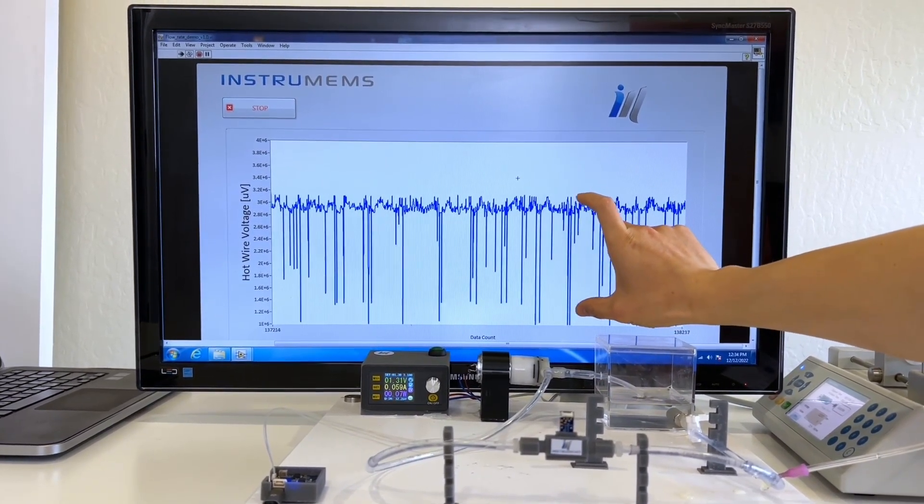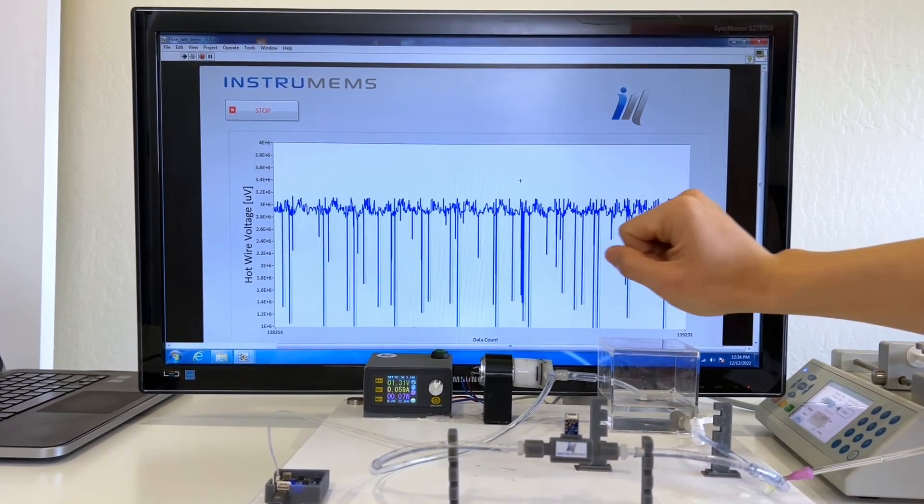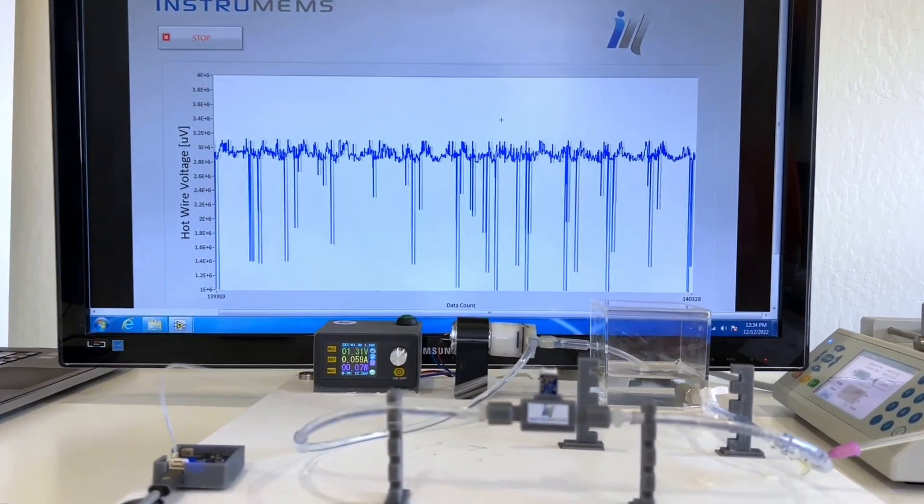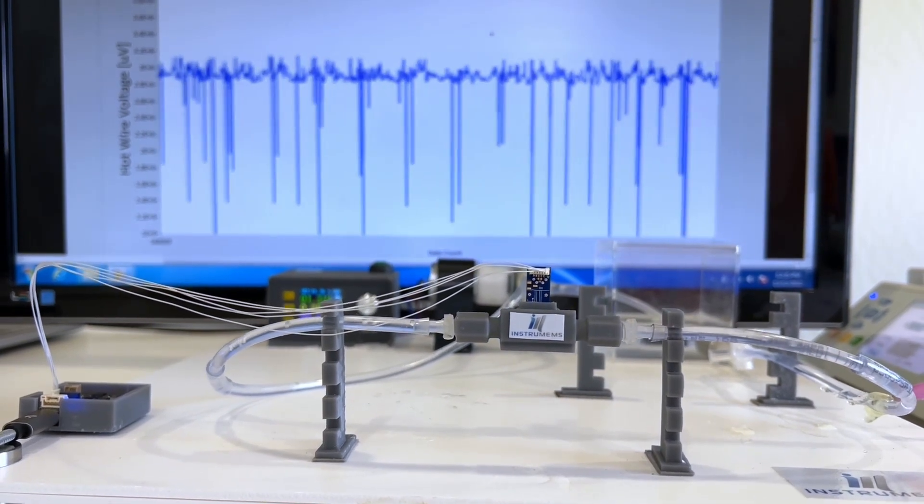Bubbles close together are detected due to the fast response time of the Instruments sensor. The width of the signal represents the bubble size. The present design of the sensor is capable of measuring a minimum size of 0.5 microliters.